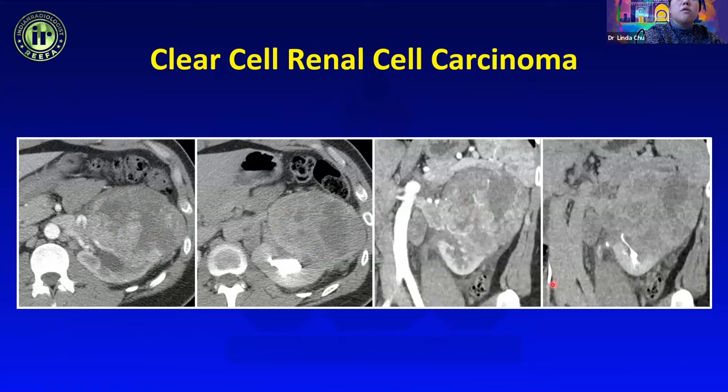This is an example of clear cell RCC with IVC invasion. When we see an aggressive-looking mass with vascular invasion, RCC is at the top of the list. Similar to the liver, arterial phase imaging is very helpful in showing internal enhancement of tumor thrombus, which helps distinguish it from bland thrombus.